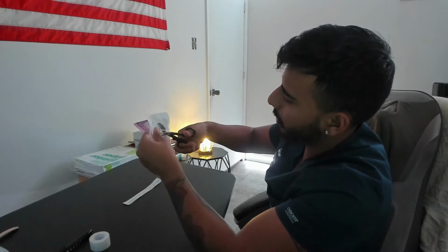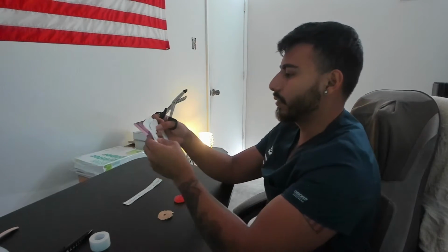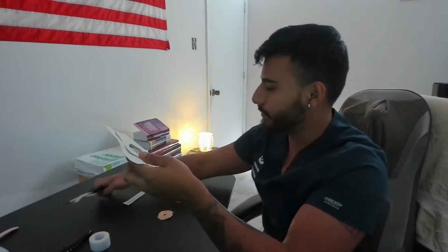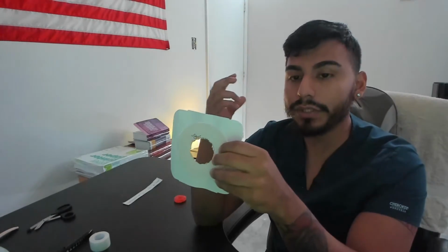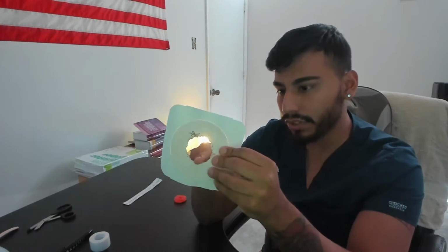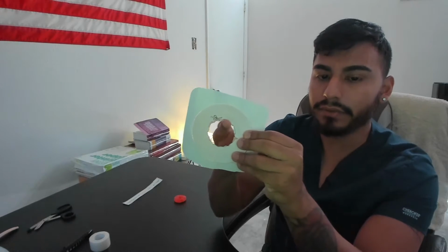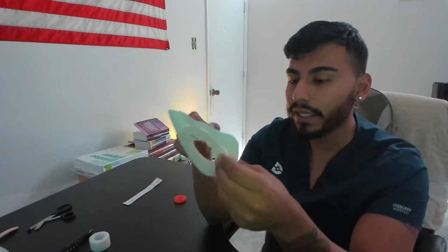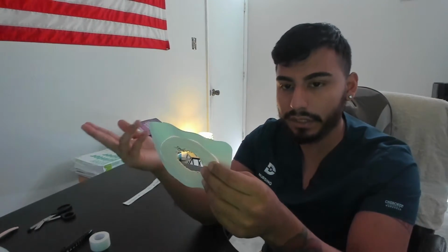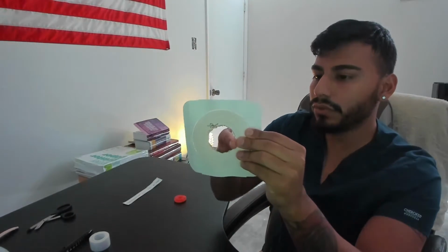Again, I perform hand hygiene and clean my gloves. I want to verbalize that. Okay, so I can dispose of this. So this is my stoma. Now, since I have gloves on, I would rub my fingers together and run my fingers along this to smooth it out, because these jagged edges have a risk of cutting the stoma or irritating it. So I would smooth it out.